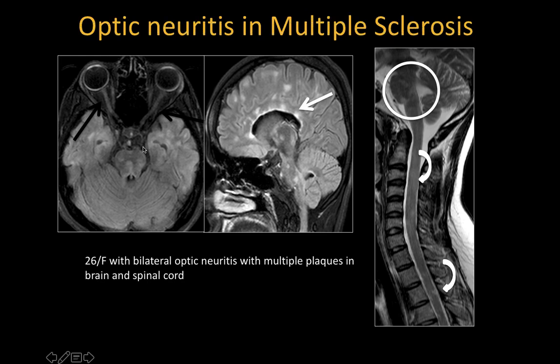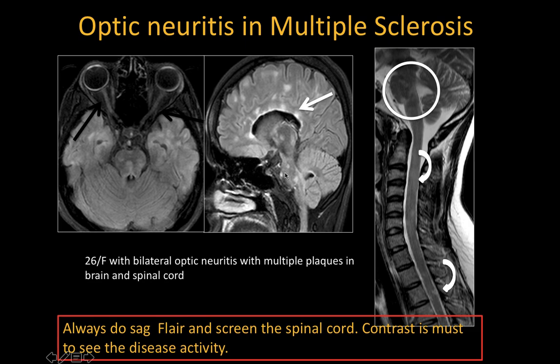This is another case — a 26-year-old female who had bilateral optic neuritis and multiple plaques in the brain and spinal cord. The plaques are perpendicular to the lateral ventricle and involve the corpus callosum — this is classically called Dawson's fingers. Plaques are also seen in the brain stem and spinal cord. Remember, spinal cord plaques in MS are short and usually involve the lateral or posterior funiculus. Sagittal FLAIR images and spinal cord screening are recommended, and contrast is mandatory to assess disease activity.